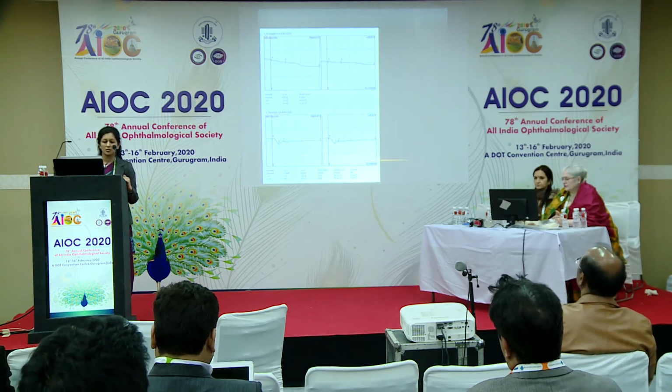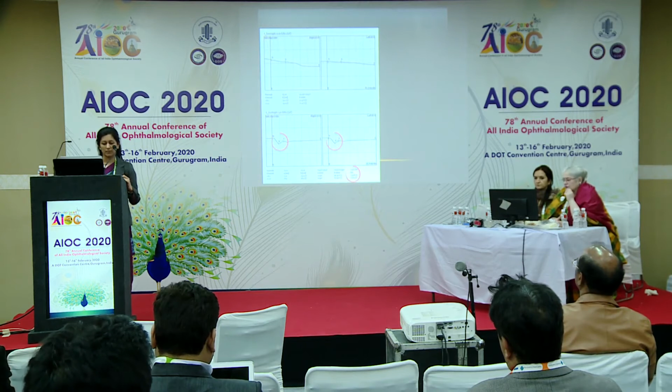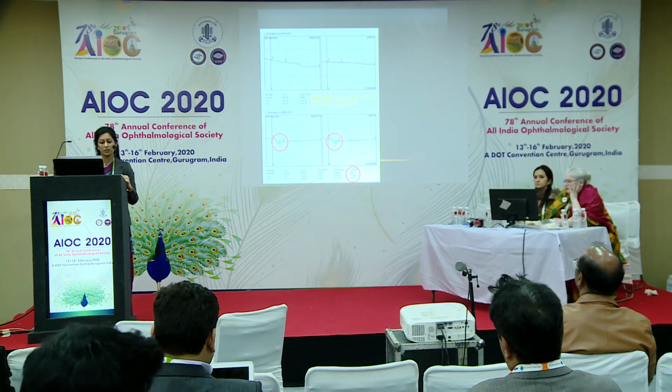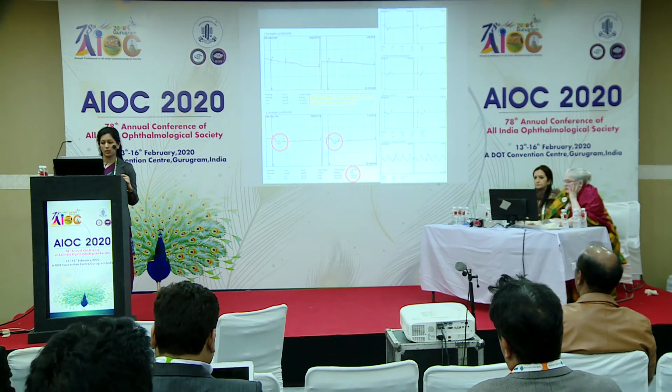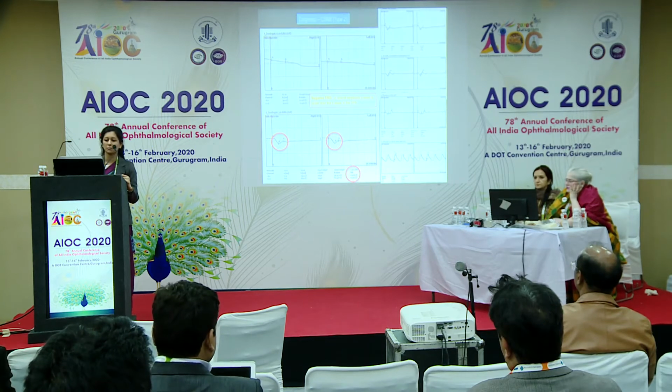Now let's look at this patient with nyctalopia, normal fundi, normal OCT, and normal vision. So again, ERG is essential here, the full field, to establish the diagnosis. If we see here, there's a negative ERG, there's a deepening of the A wave and a flattening of the B wave with the inverse B to A ratio, and this has to be seen in the single flash response. The other protocols are normal. This is a case of CSNB type 2.